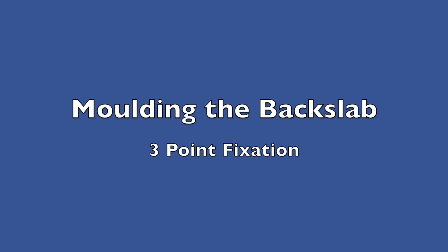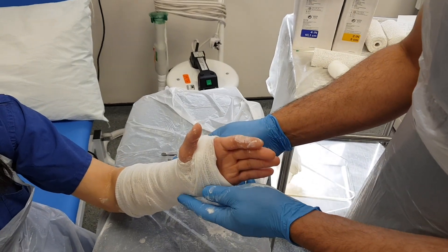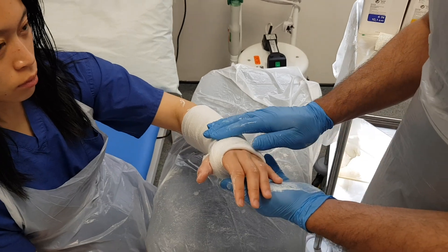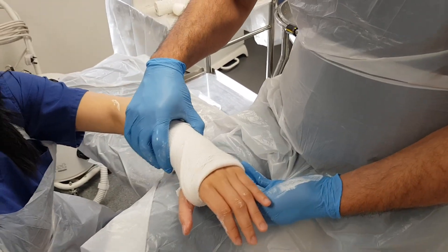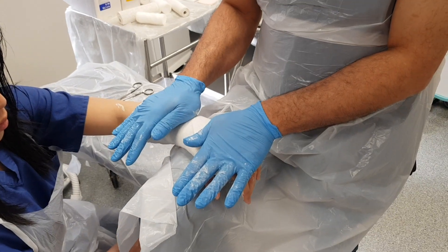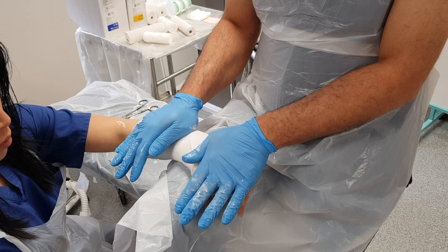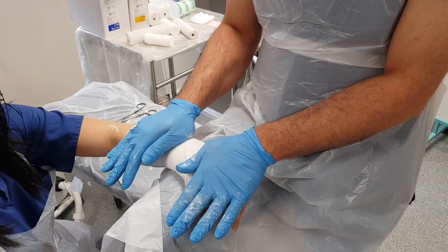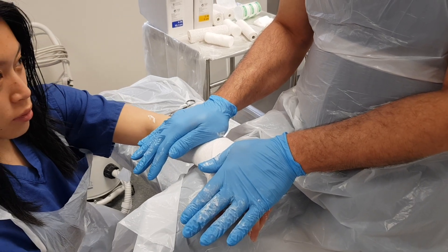You could leave the plaster like that, or you could use a technique called three-point fixation. This involves putting pressure on the plaster in three different places, which helps to reduce the fracture and get it into a better, more controlled position. I want to mould this to provide three-point fixation with a little volar angulation and a bit of ulnar angulation. I'm going to rest the wrist on my knee with the fracture site on top, apply a little pressure here and here, giving a nice volar angulation. As it warms up it shouldn't be too painful, and we apply gentle pressure to squeeze the plaster into good contact and get good control of the fracture. Hold onto that until the plaster has set.